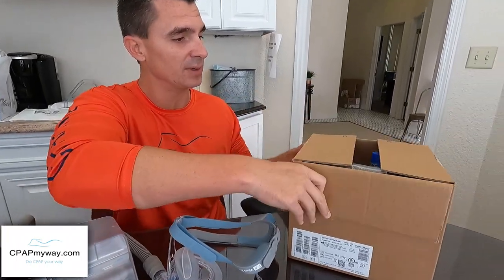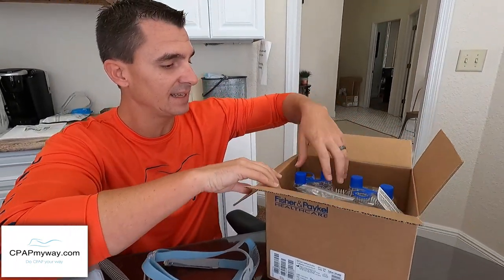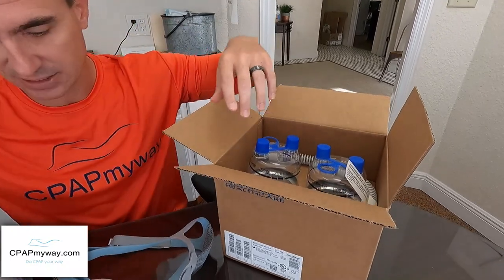A lot of users would turn down the humidity and just try to make do, but still kind of dry out. For those people I now have the resolution — it's the HC-150 heated humidifier. Let me show you the kit.